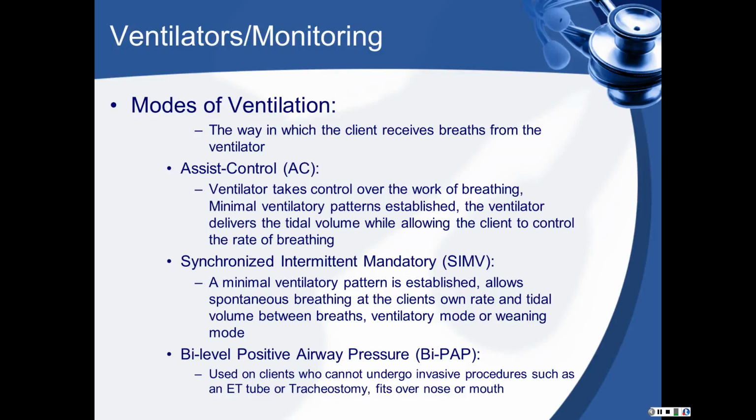The SIMV can also be used when an attempt to wean the patient off is done, and when it is used for weaning the patient, the rate is decreased gradually from a delivery of 12 breaths to a delivery of 2 breaths during the weaning mode.